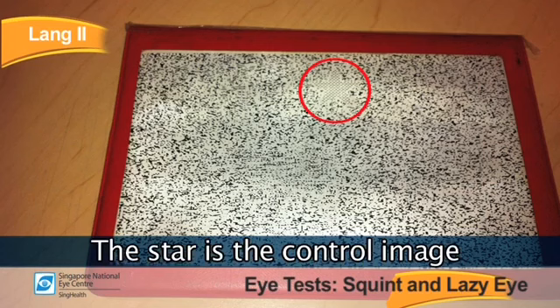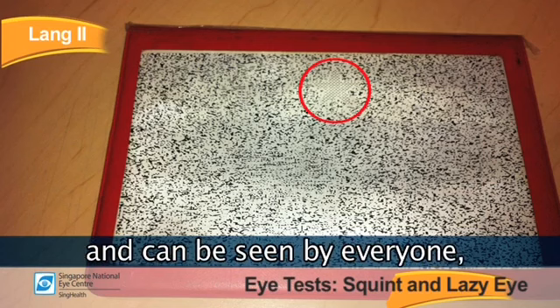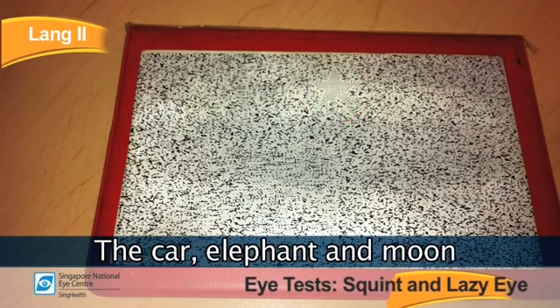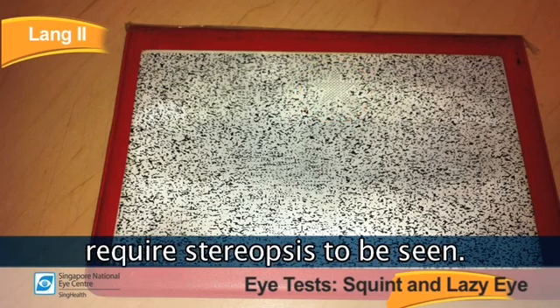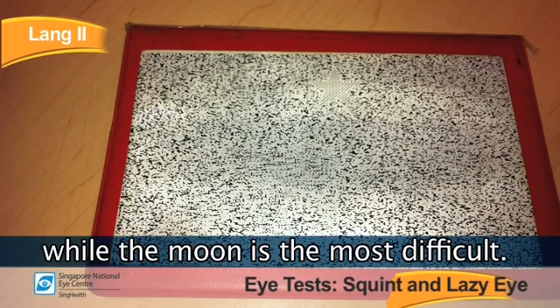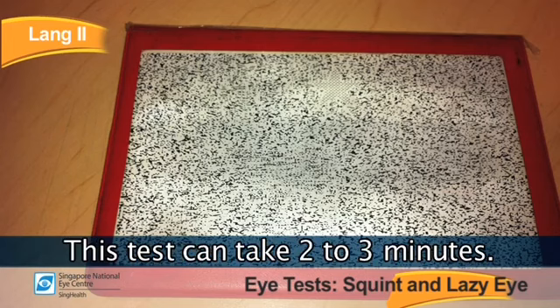The star is the control image and can be seen by everyone, with or without stereopsis. The car, elephant, and moon require stereopsis to be seen. The elephant is the easiest to see, while the moon is the most difficult. This test can take 2 to 3 minutes.